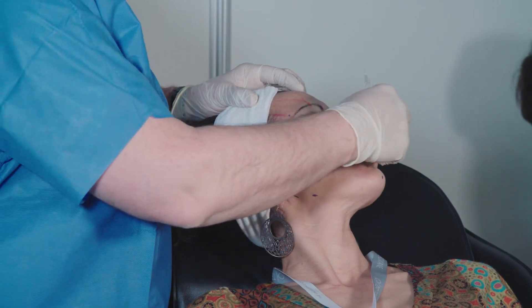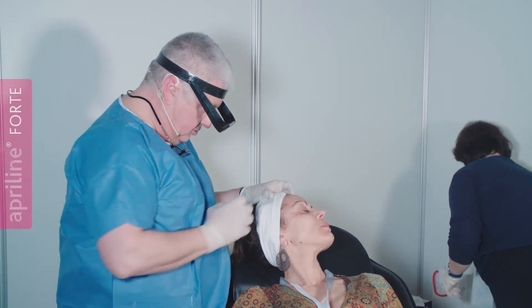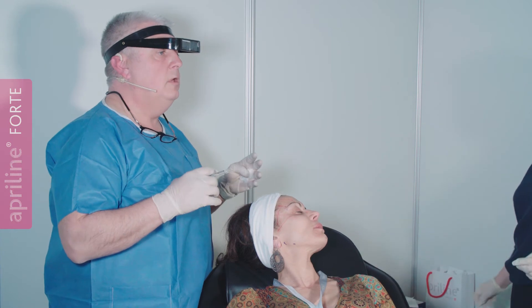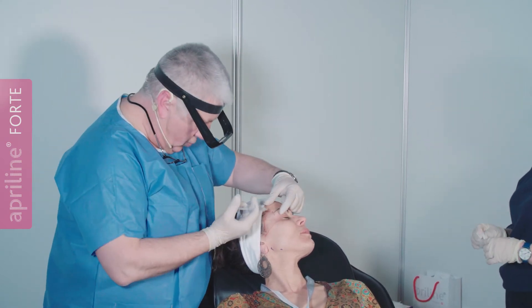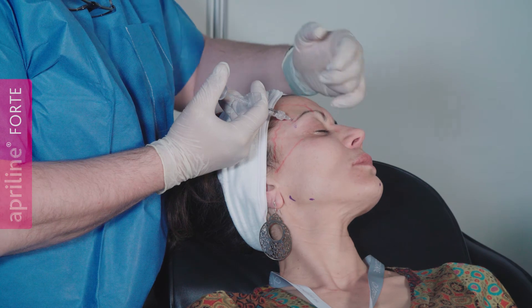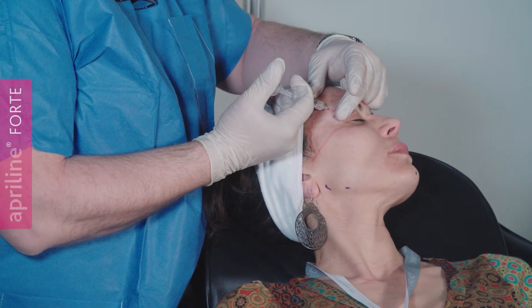Now I go back to the frontalis area. I changed the product — I'm using the Apriline Forte, a good cross-link product. I want to feel deep near the bone this depression I have just over the end of the eyebrow. I injected near the eye with the Apriline normal — less cross-link product, less inflammatory reaction — because the more cross-link product you have, the more inflammation. So around the orbit I use Apriline normal. Over the eyebrow I can inject near the bone because there are no nerves or vessels here — they are all superficial or laterally near the superficial temporal artery.